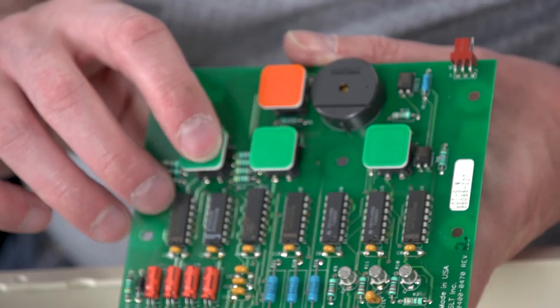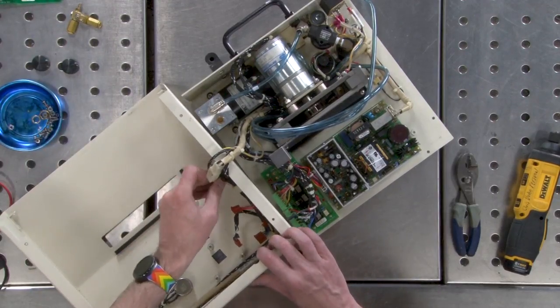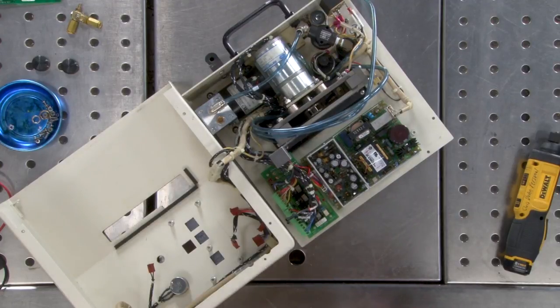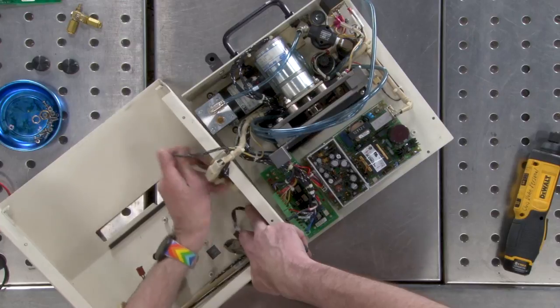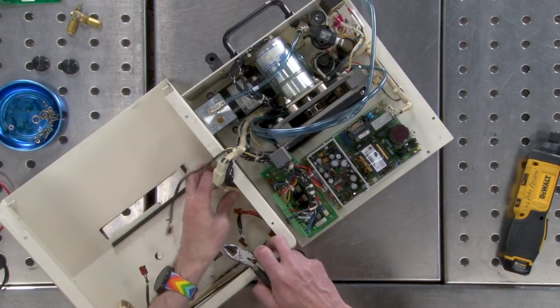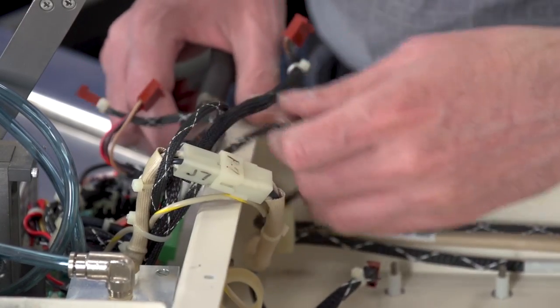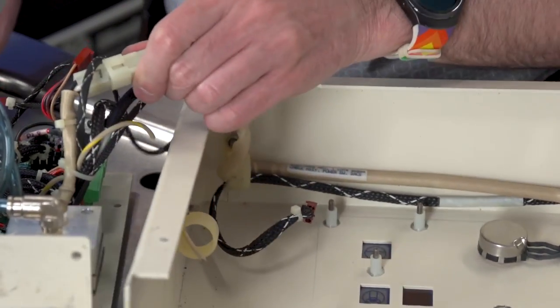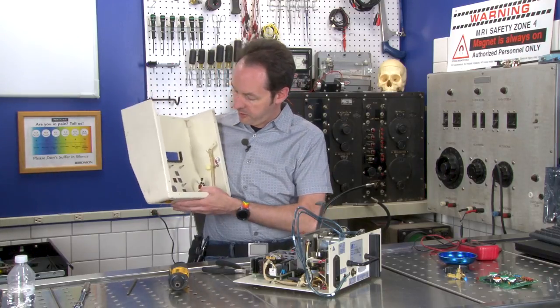So that's just an orange light — these are actually buttons that light up. There's our control system, the brains of the operation. Pull all those out, leaving just the switch and the potentiometer, neither of which we really care about.